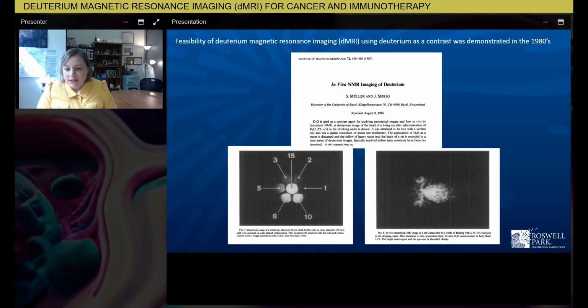Then we had this idea of using deuterium labeling in imaging. At first we were studying T cell kinetics, and I had to extract T cells out of every possible tissue. It was a very painful process and took a lot of mice. But what we stumbled upon was that deuterium could be used in magnetic resonance imaging. So I thought, wherever I see my T cells, I could probably see deuterium. And therefore, I could jump from extracting cells out of tissues into whole body imaging to detect where T cells were abundant.